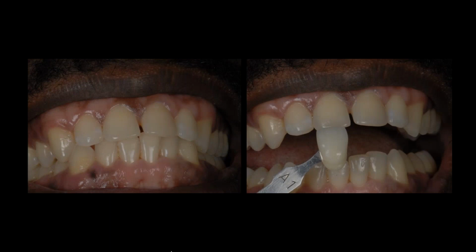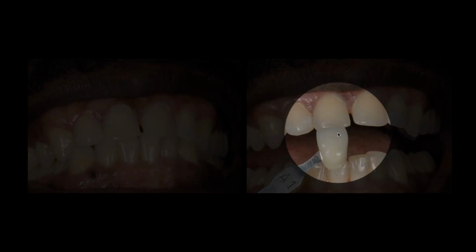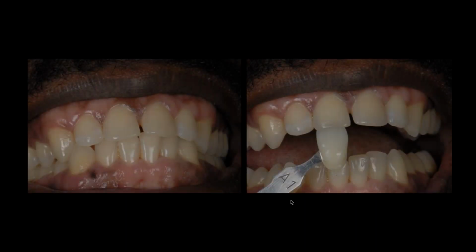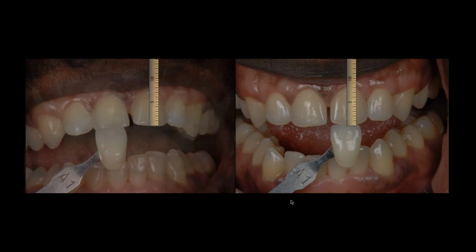When you take your photographs with a patient in a dental chair, as I've done here, watch what's happening. Patient's laying back. I'm trying to move the camera up and get over the angle. I'm putting a shade guide underneath it for my reference point. If I take that same patient out of the chair and take the exact same photograph, look what happens when I compare the 2 photographs.